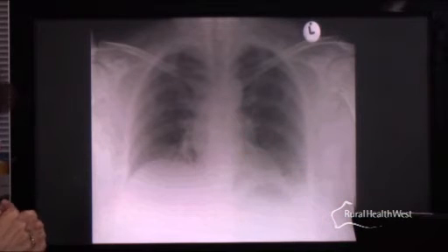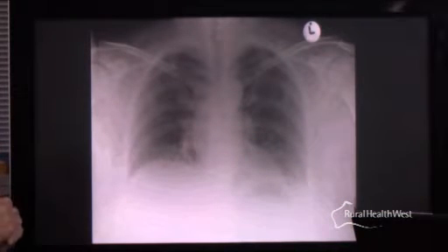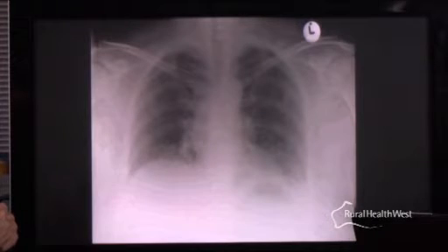First thing is that chest X-rays and radiographs in general are really quite difficult to look at and interpret, and having a system will help. I've got a chest X-ray of probably a fairly typical patient which you might get a radiograph of, and the first thing is to have a look at the film and see if you think it's adequately penetrated. So you want to be able to see if you can see the thoracic spine reasonably through the mediastinum. Can you see the left hemidiaphragm? That looks pretty hazy. So it's not really very well penetrated.